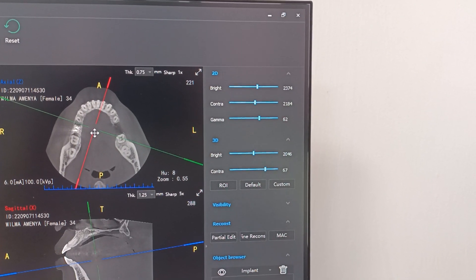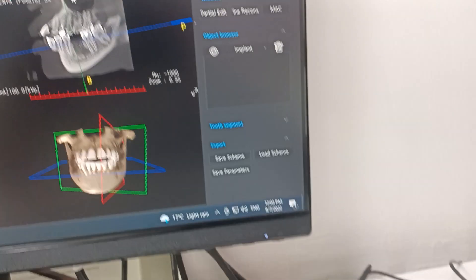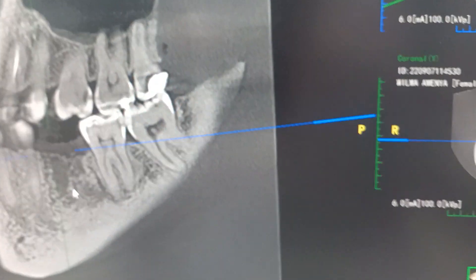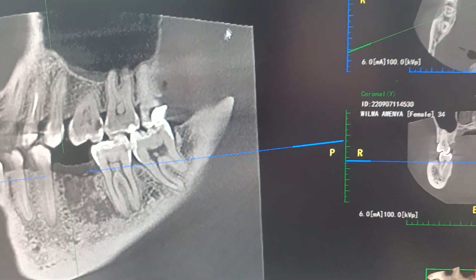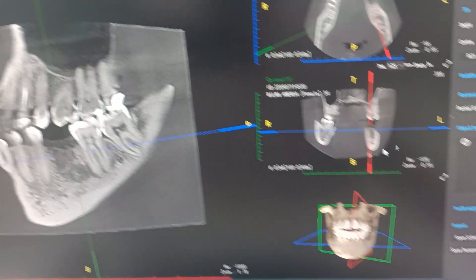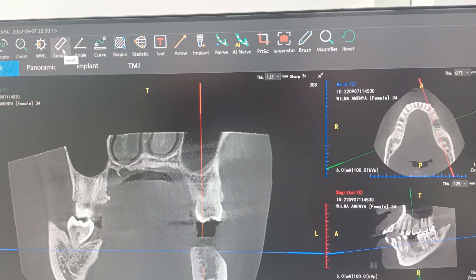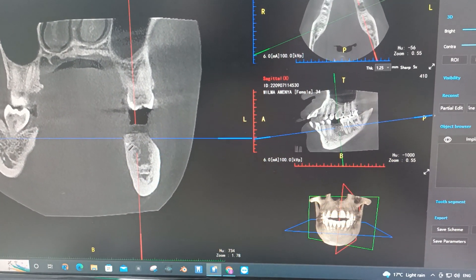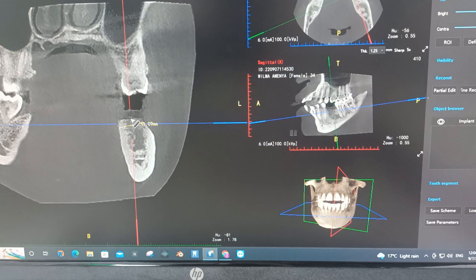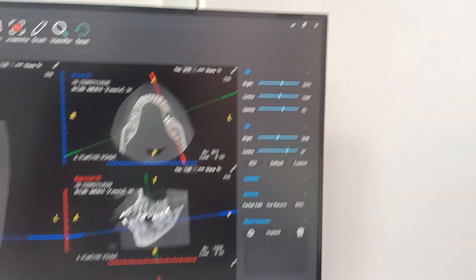We can then come and rotate to the left area and observe the 3.6 area. The 3.6 area had an extraction some time back and the bone hasn't fully formed yet. We can come and put our cursor there, then examine the bone. There's a length measurement — click that — then come and look at the width and the height of the ridge.